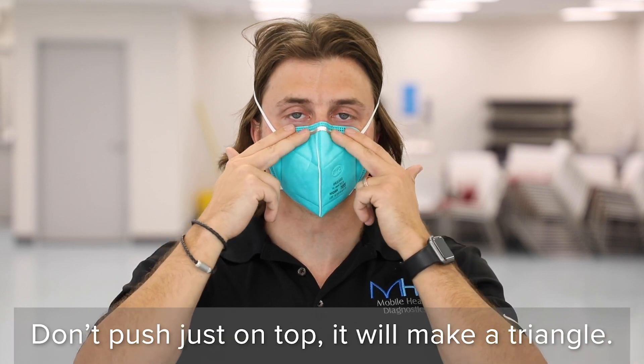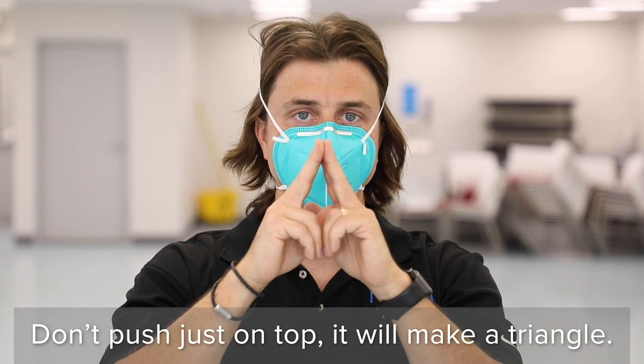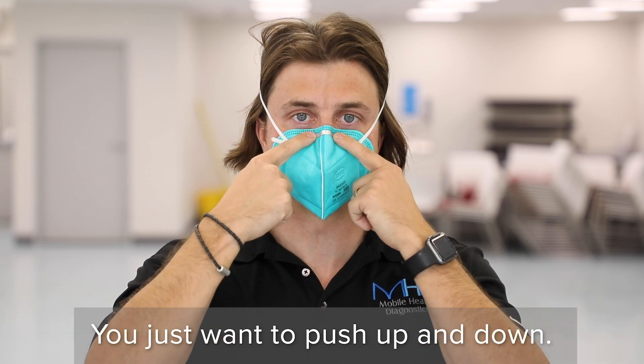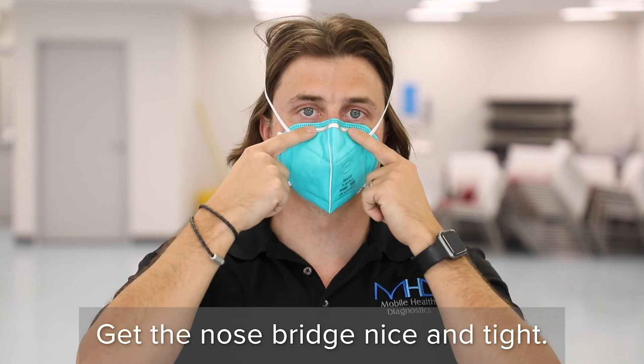Don't push just at the top of the nose bridge, because that can create a triangle which lets air into the N95. Instead, push up and down the entire nose bridge nice and tight, pressing a little hard on it.